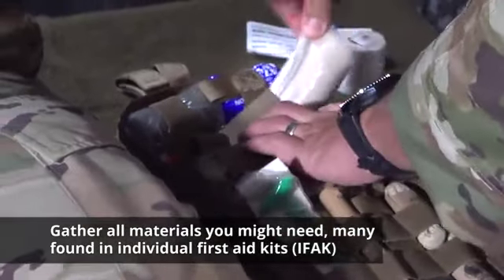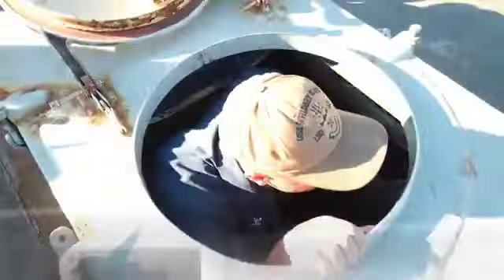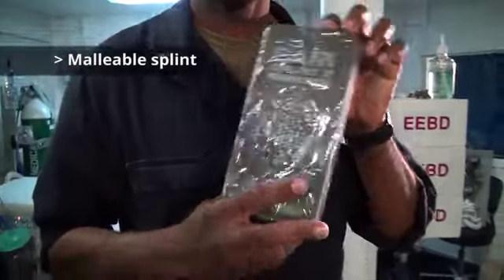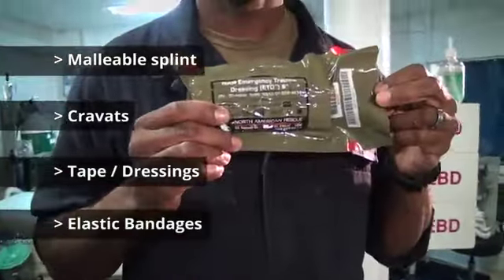Many of these are found in the individual first aid kits, like gauze, a cravat, an elastic bandage, and tape. Others may be found in combat lifesaver kits or in a combat medic bag. This might include a malleable splint, additional cravats, tape, dressings, and elastic bandages.